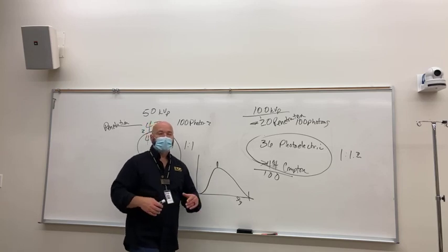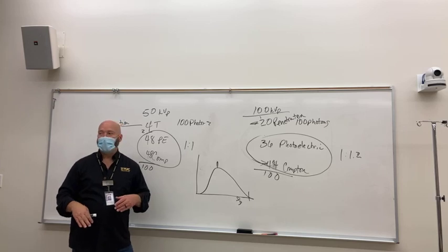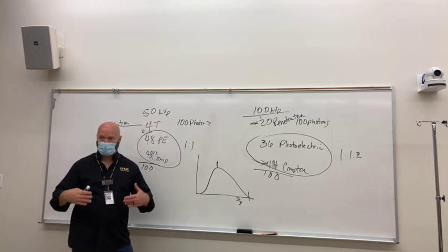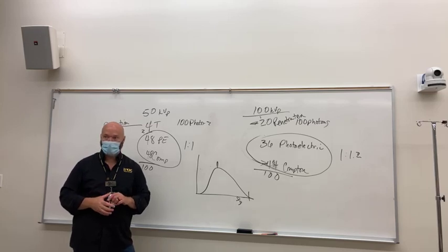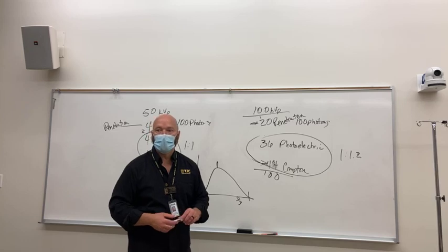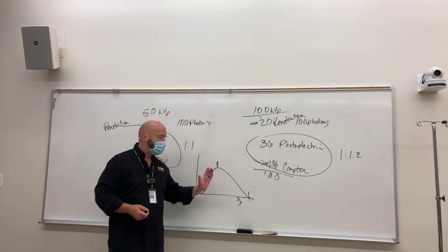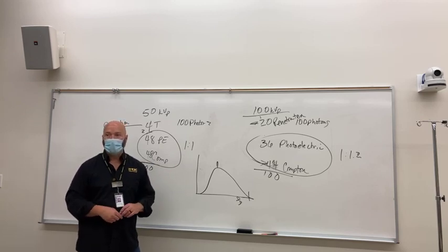Okay, so it's not until you get to increasing kVp with a decrease in mAs that you get an actual reduction in dose. Does that help? So it's just because they're getting more of the lower energy ones because it's only 1/3 of whatever. Right, exactly, because most of your beam energy at any kVp is very low.